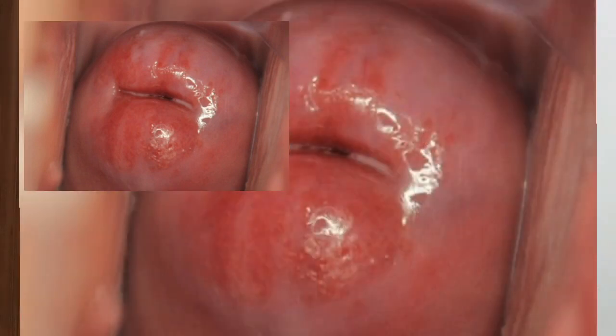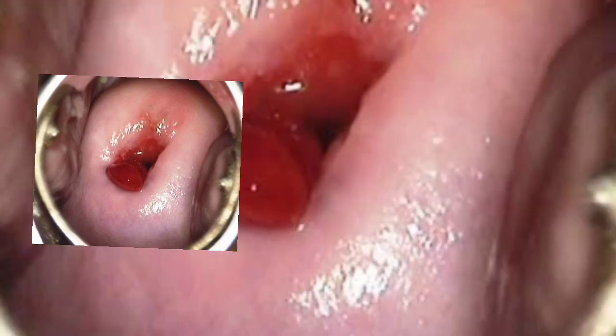On the cervix, note if there is any ectropion — where the endocervical columnar epithelium is present on the ectocervix, giving a reddish appearance. Note the presence of any polyp: in the picture you can see a fleshy reddish mass around the 7 or 8 o'clock position near the os. Also check for nabothian follicles, which are mucus retention cysts.